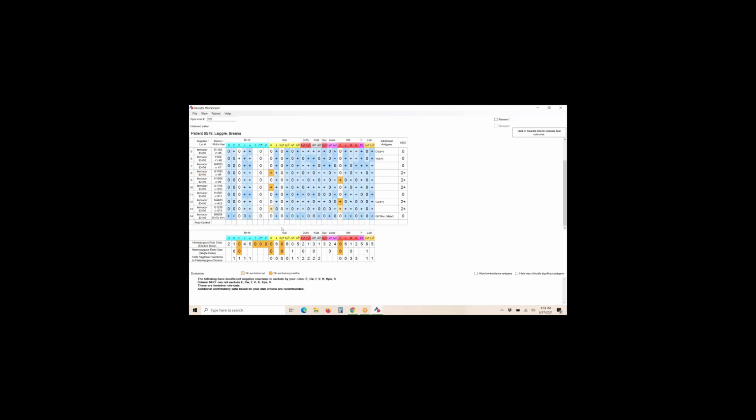Now in the case of K, we actually have two cells here that we have dark orange that we're saying this antigen is most likely what the antibody is directed against, so anti-K most likely. And we have a 2+ there and another one here. We have a 2+ here. And then similarly with S, we have the same thing. We have 2.